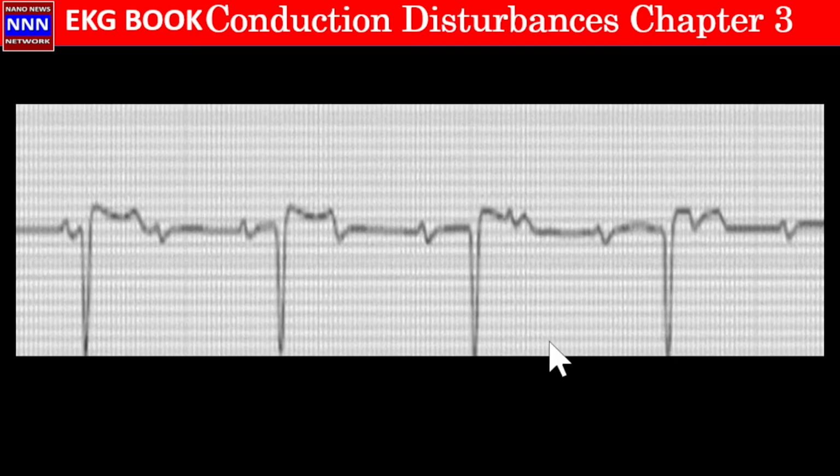Let's look at another example here. Here we have a ventricular rate which is exceedingly slow, maybe in the range of like 40 or so. Then we have the P waves which are much faster, and the PP intervals are constant. But the PR intervals are not constant, and the morphology of the QRS complexes are similar, and the RR intervals are similar.